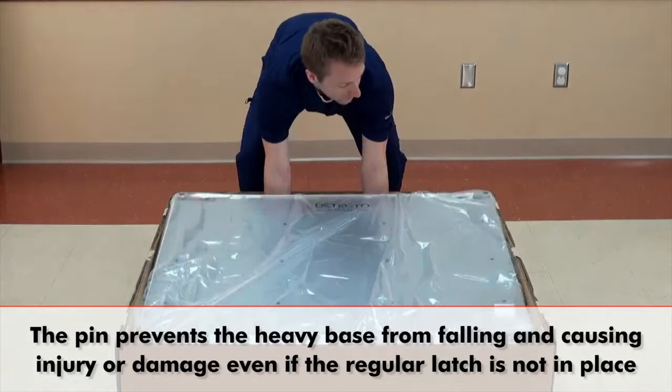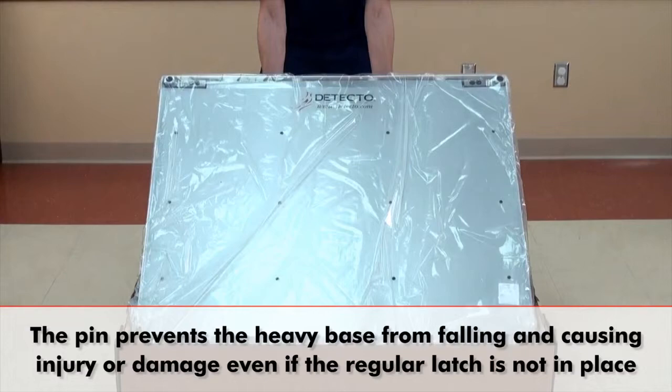As demonstrated here, the pin will prevent the scale's heavy base from falling and causing injury or damage, even if the scale's regular latch mechanism is not in place.